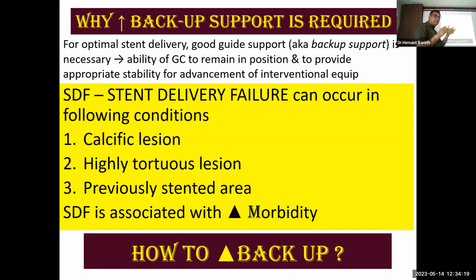Because normally if you pass another stent through a previously stented area, there is a likelihood of that stent getting stuck in the previously stented area. And once that happens, there are a lot of problems. If you are unable to pass your stent, it can get stuck there, may not move. So the stent is not moving forward or backward, or it may even embolize. The stent may embolize, and so a lot of problems.